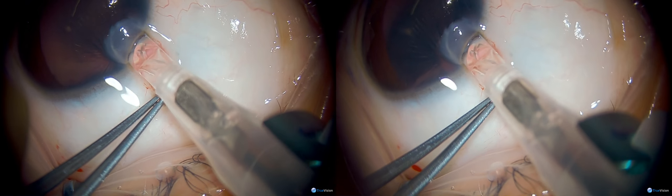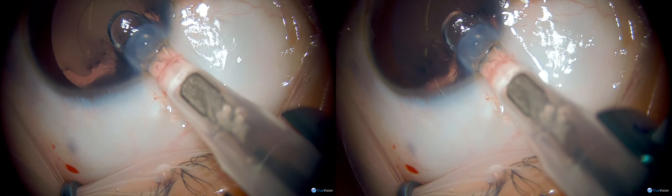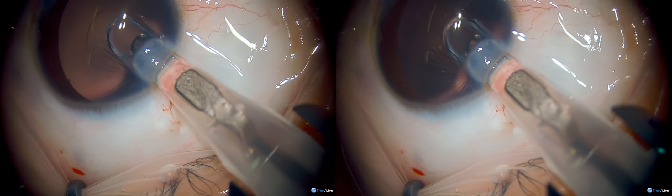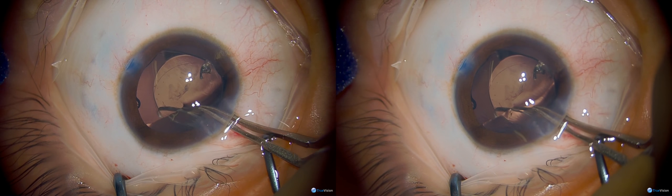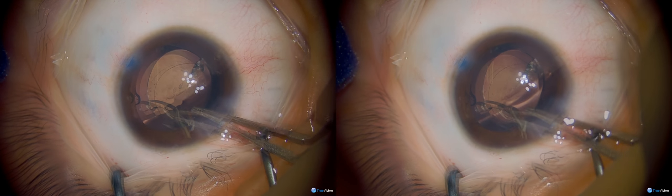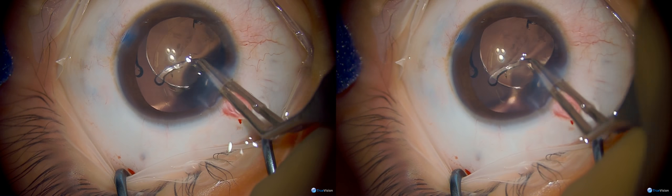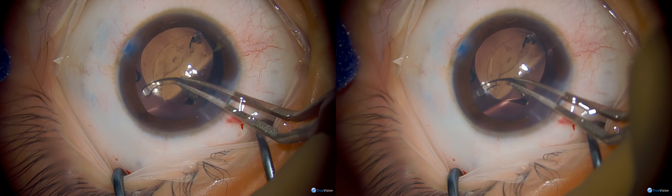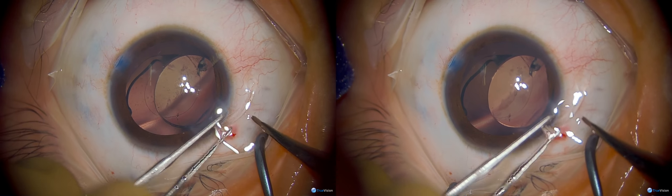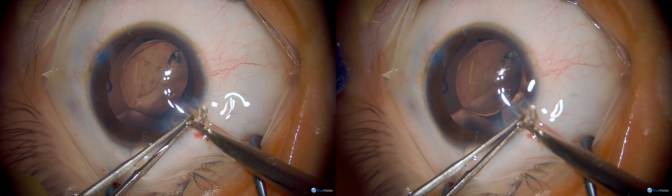During the injection of this one-piece lens, you can see the plunger is out a little bit further than normal, and once the lens is in the eye it's visible that there's a crack in the lens implant off to the right-hand side. There are also some other scratches and cracks extending towards the middle, and the decision is made in this case to explant the IOL and simply replace it.